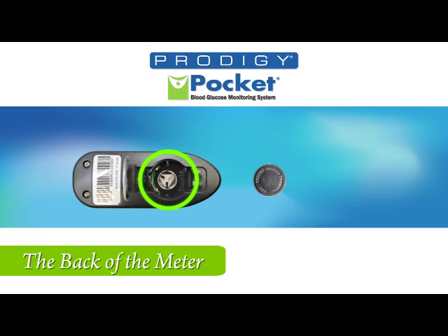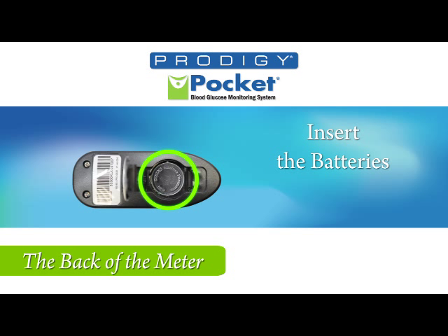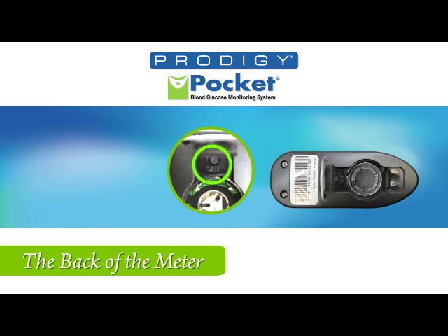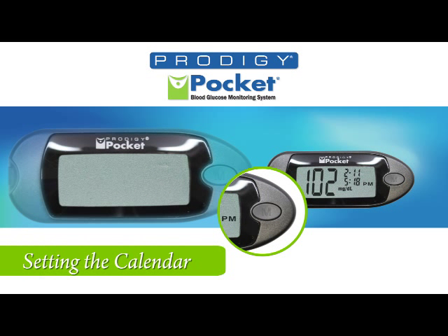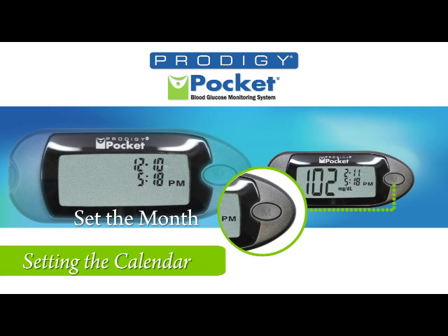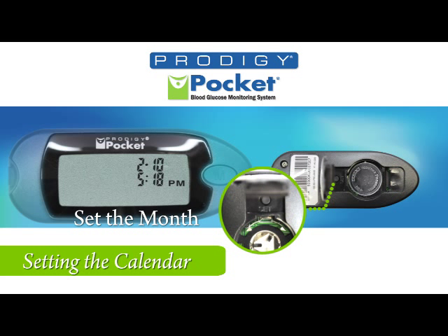First, start at the back of the meter by inserting the battery. The molded-in symbol on the lid ensures the battery is oriented properly. With the battery installed, press the set button and flip over to the front without closing the back plate. Press the M button for the desired year. Flip over to the back and press the set button, then back to the front using the M button to set the month. After setting your month, flip back over and press the set button.